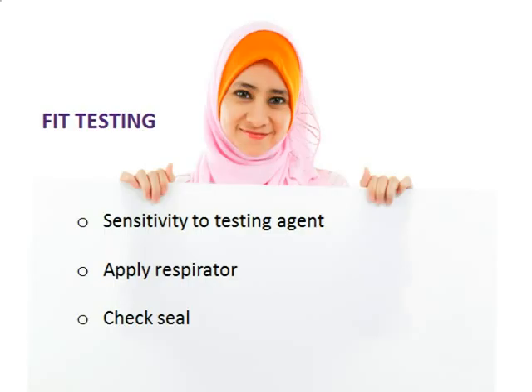In this qualitative method, the sensitivity of the testing agent that is used for taste or smell is tested with a healthcare worker to determine if the worker can indeed taste or smell the agent. Then the healthcare worker puts on the selected respirator. The healthcare worker secures the respirator over the nose and mouth to assure that the respirator is properly seated on the face and provides a tight seal.